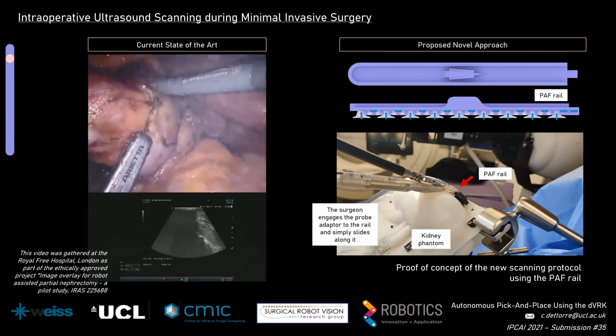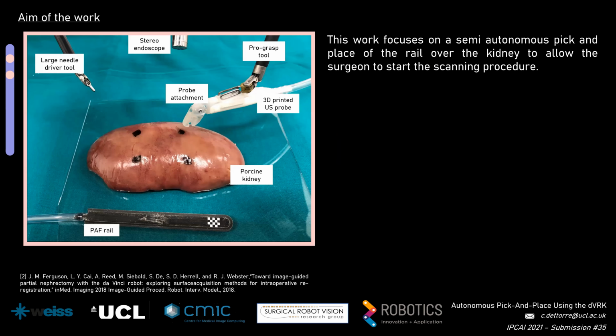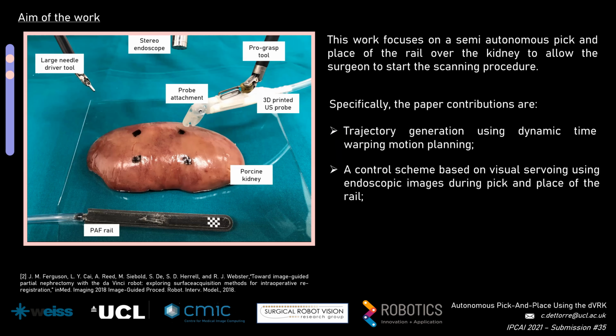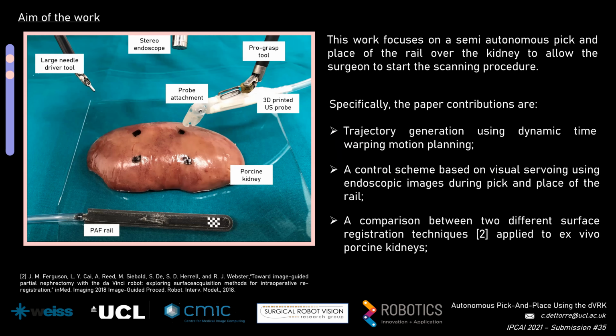its length. The aim of this work is to develop a software architecture that allows to autonomously execute the pick and place task, triggering the start of the scanning procedure executed by the surgeon. Specifically, the paper contributions are a trajectory generation using dynamic time warping, a control scheme based on visual servoing, a comparison between two different surface registration techniques, and a preclinical user study comparing the performances of 5 surgeons.